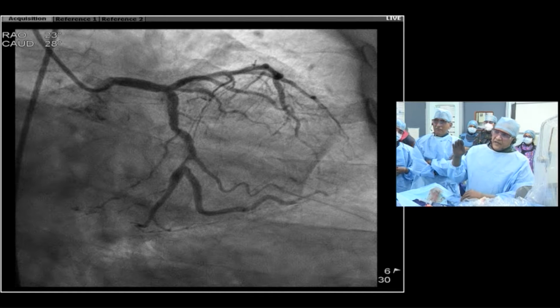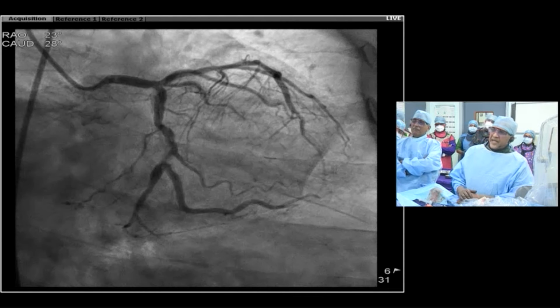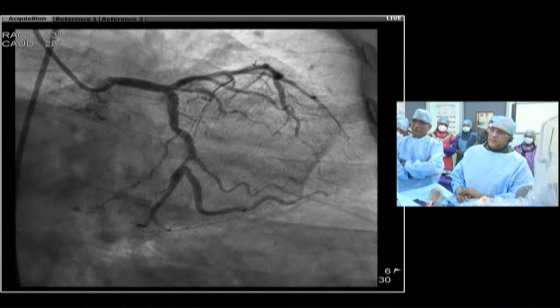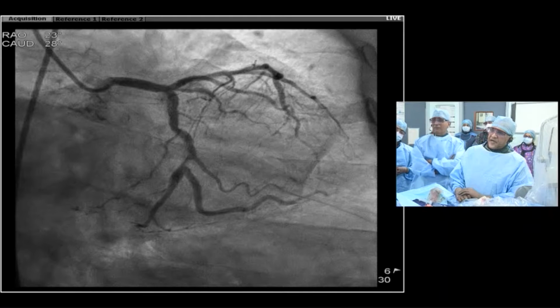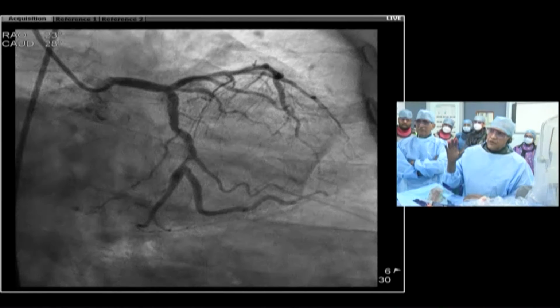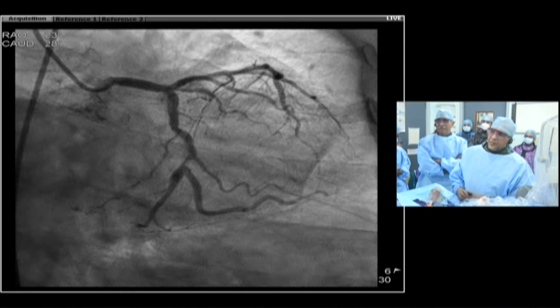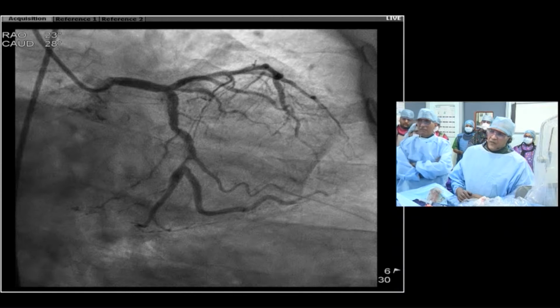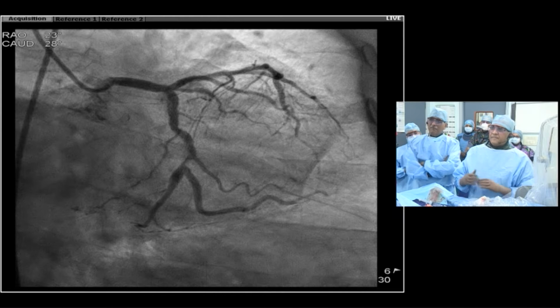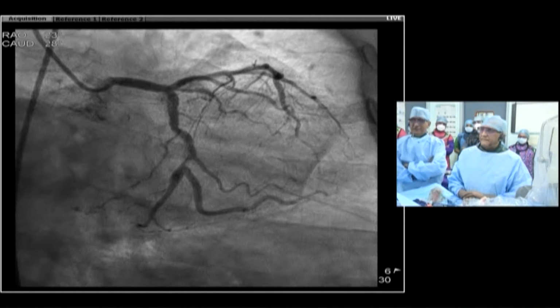So here we have a heavily calcified lesion in a tortuous circumflex with an eccentric plaque just before a very major bifurcation, not involving either of the branches of the bifurcation. So I think this is interesting. And we plan to show you a rotational atherectomy using differential bias and using a larger burr, where I think it might work. We also have a standby laser just in case that fails. Anything that you'd like to ask, or any discussions?